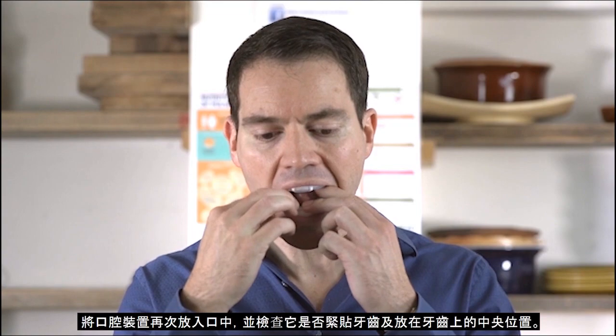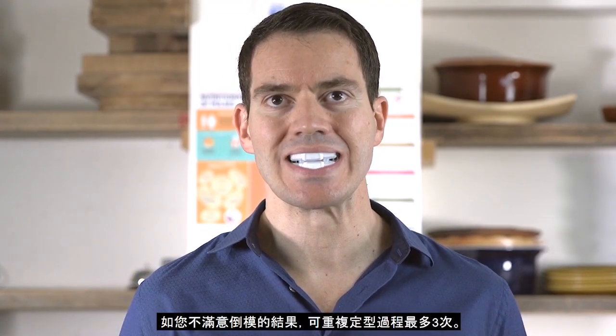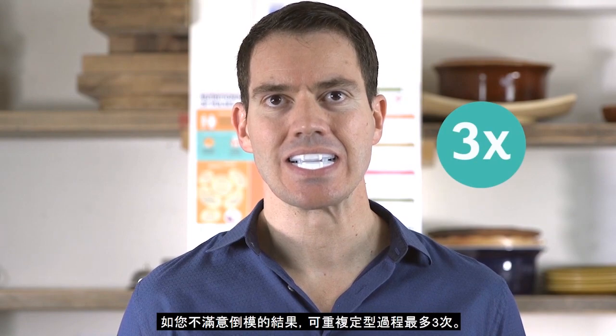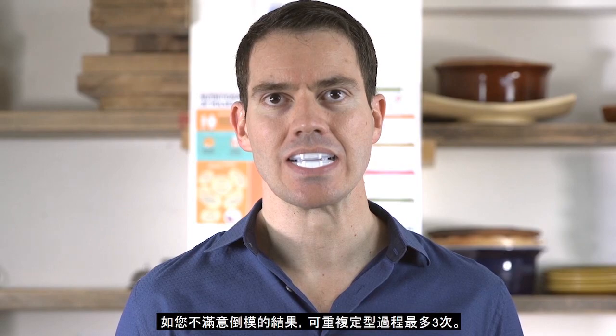Place the Oral Device in your mouth and check it fits securely and sits centrally on your teeth. It's important to remember that the moulding process can be repeated up to 3 times if you are not satisfied with the result of your moulding.